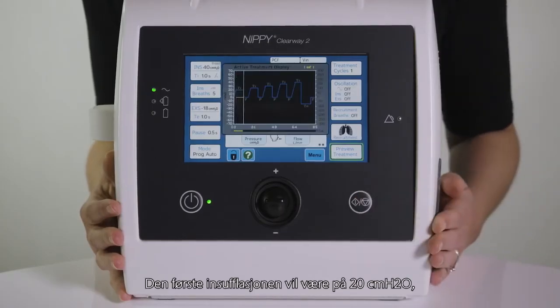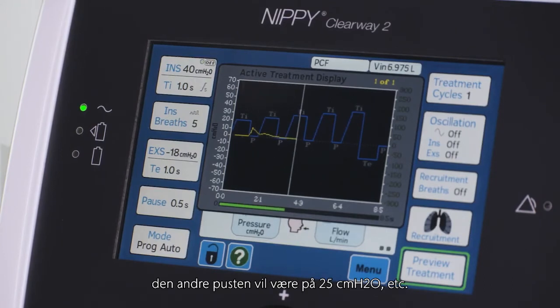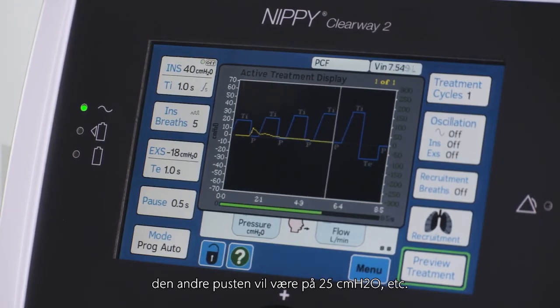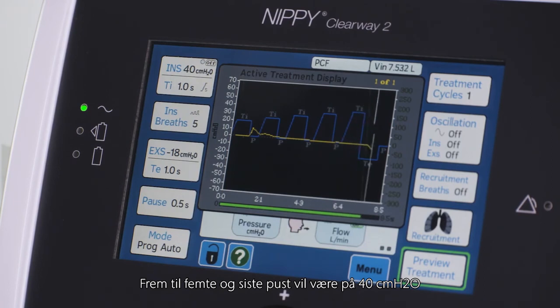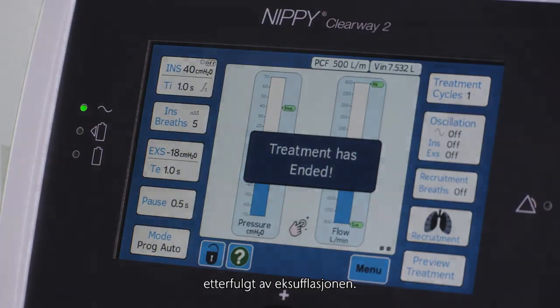The first insufflation will be 20 cm of water, the second breath will be 25 cm of water, and so on, until the fifth and final breath will be 40 cm of water, followed by the exsufflation.